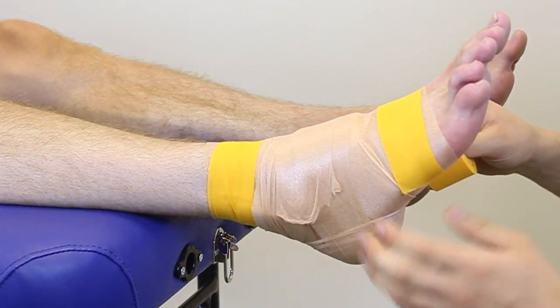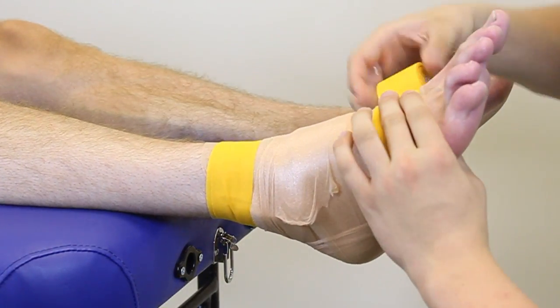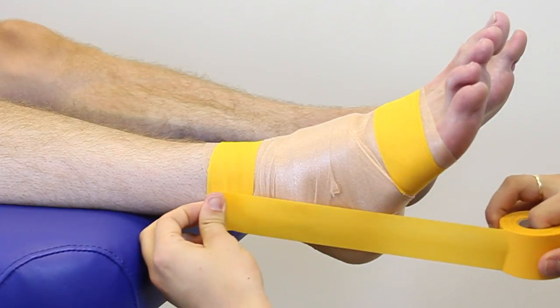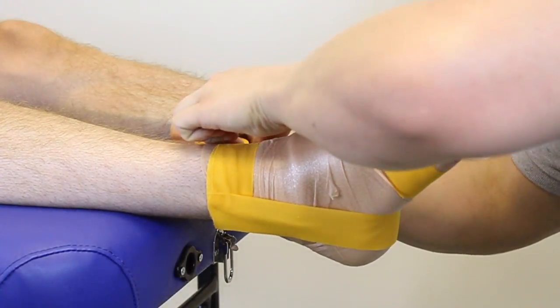We're going to apply the second anchor at the base of the foot and do exactly the same process. Next we're going to apply a stirrup, going from one side all the way down to the opposite and then attaching back at the top anchor.